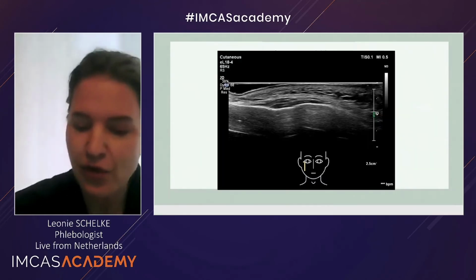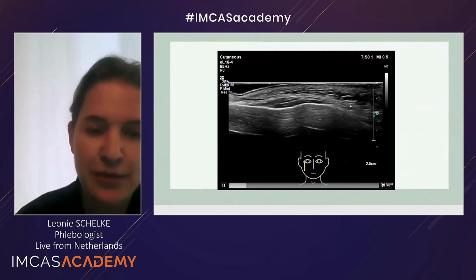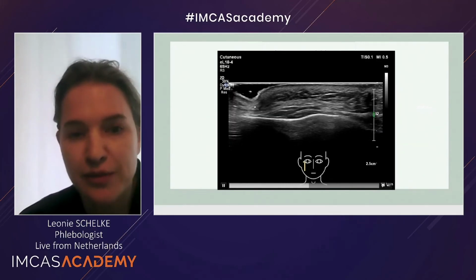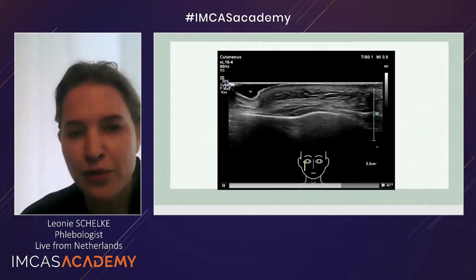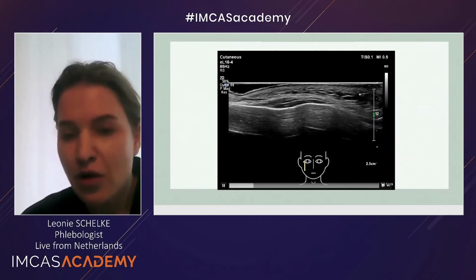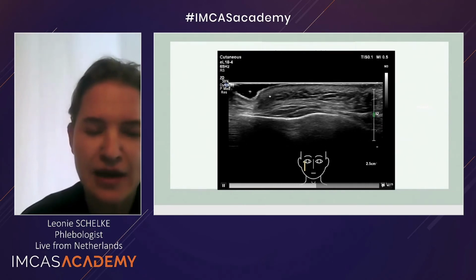And look what's happening if you smile. Look at the subcutaneous layer. It's been pushed up. So the movement of your face, the dynamic muscles, are causing movement of the superficial plane. And if you use too much heavy product in this, you'll have a very unnatural appearance.